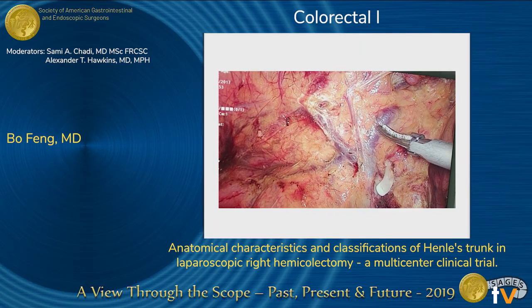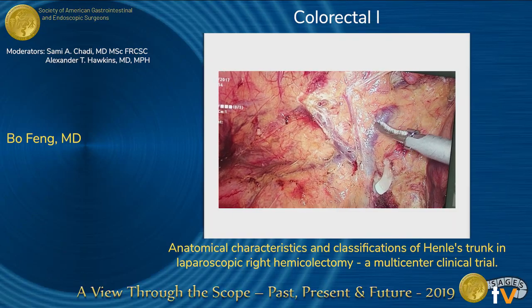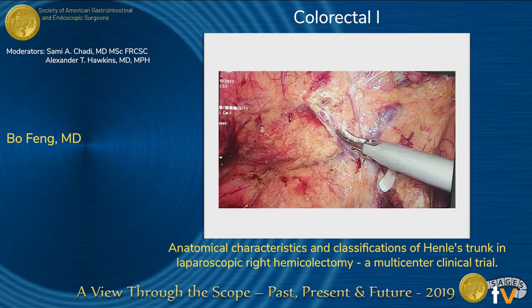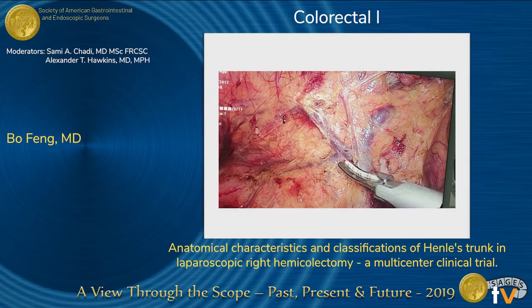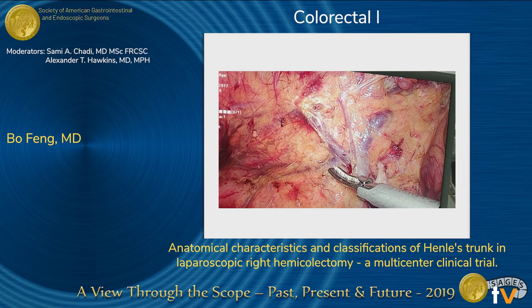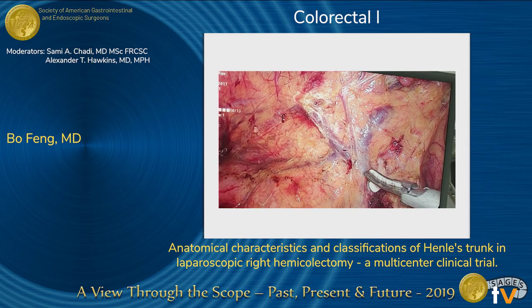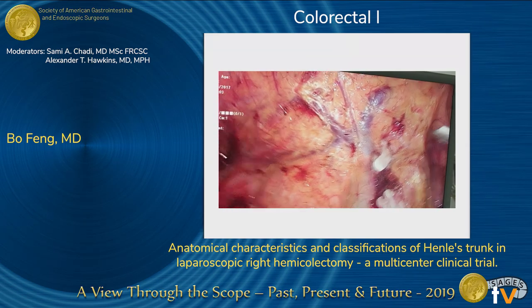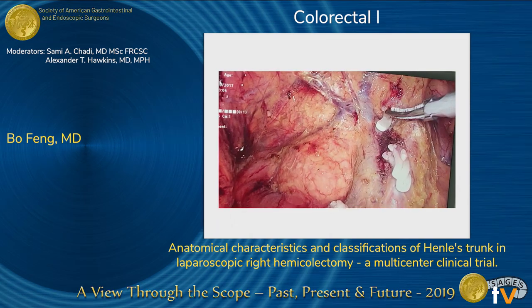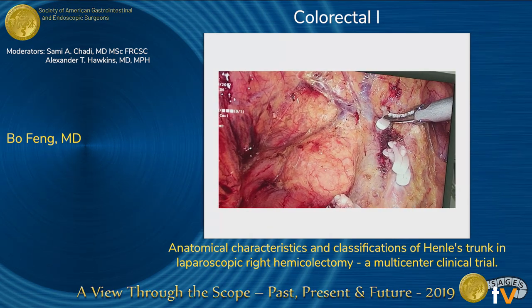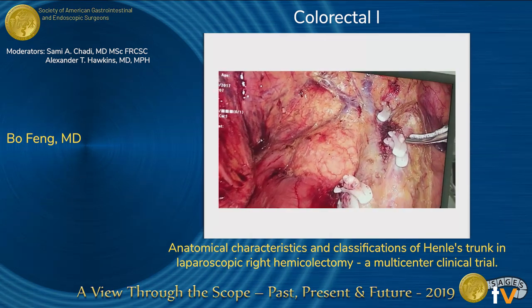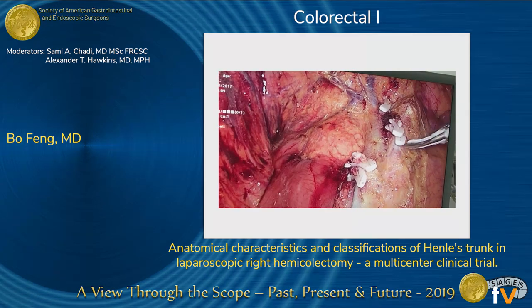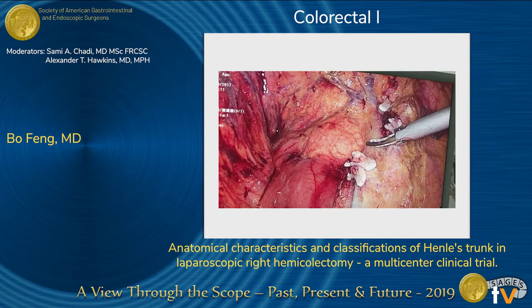This is another case. As we can see, there appear to be three veins originally from the colon, but on closer inspection we identified only two veins from the colon — the RCV and SRCV. So this is actually a type 2 case.